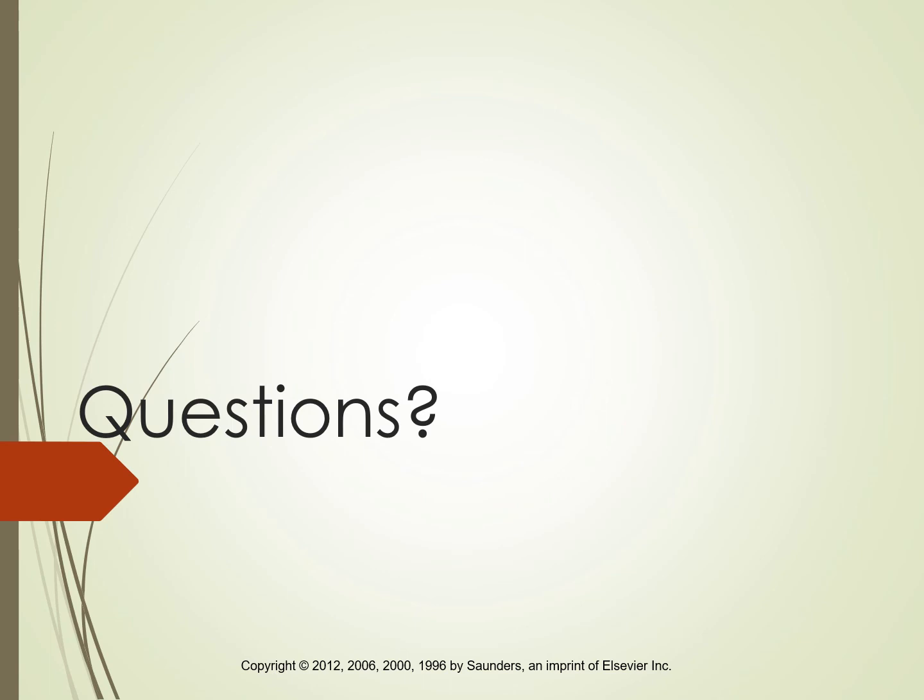But now we have tools to be able to recognize it, to be able to measure it, to be able to look at maybe some of those other factors, those terminology that we needed to have in order to describe what exactly it is about this image that didn't quite look right, right? And now we can see too in a lot of those others that there's a lot of things that could cause periodontal disease that aren't just brushing and flossing, right?